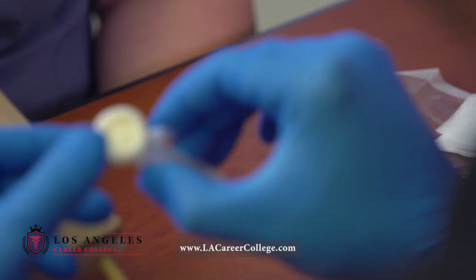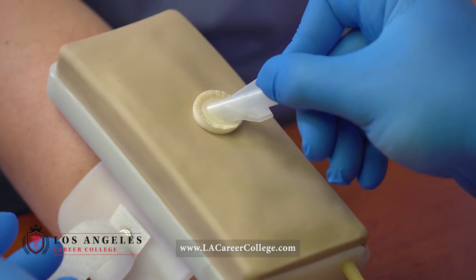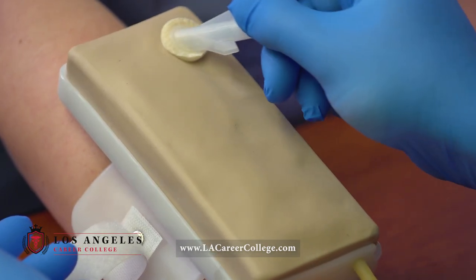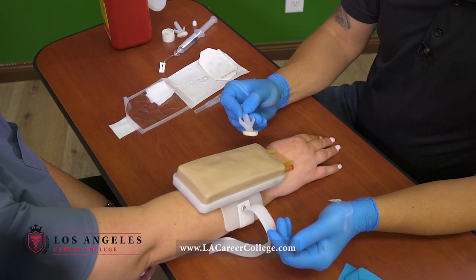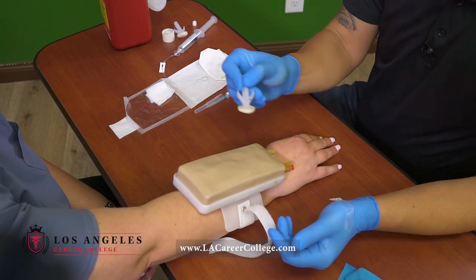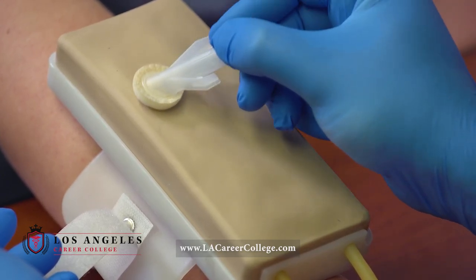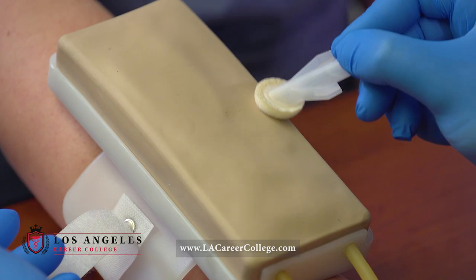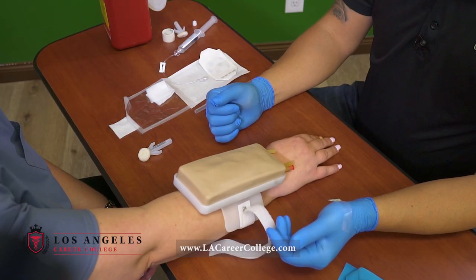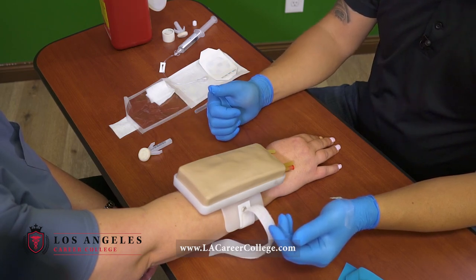I will go ahead and grab my alcohol. What you want to do is start in the middle, in a circular motion, work your way out. When you work your way out, you do not want to come back in. You do not want to go crisscross. Again, start in the middle and in a circular motion work your way out. Then let it dry — don't fan on it, don't blow on it, just let it dry on its own.